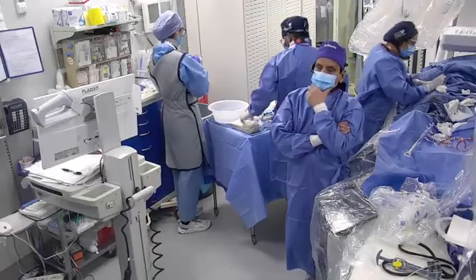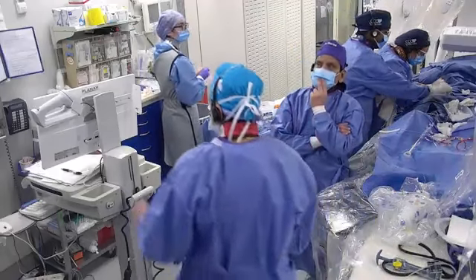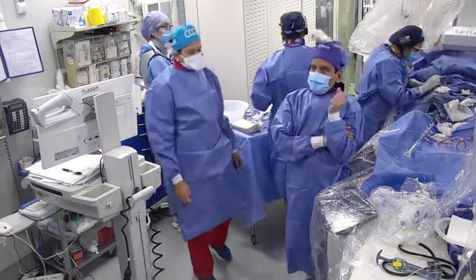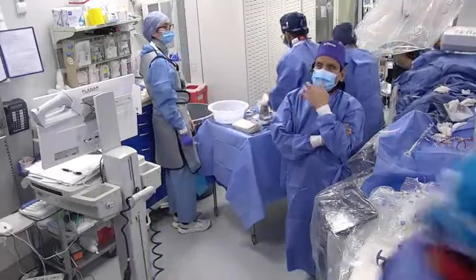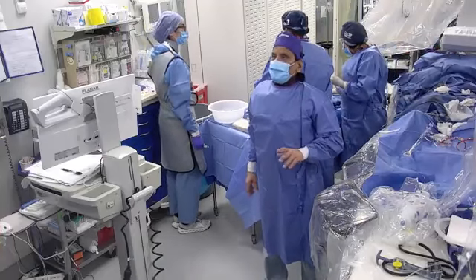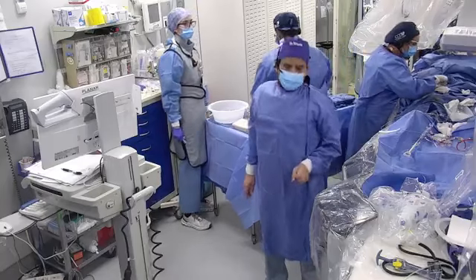Acute MI with large thrombus burden, in a young person without calcium, would you use it? No, it doesn't help, because in that case I think your aspiration, although the TAPAS and TASTE trials show different, but with the thrombus burden we see in the Indian population, if you do them without aspiration, the whole artery will shut down. So in those cases we do aspiration and then put a stent.